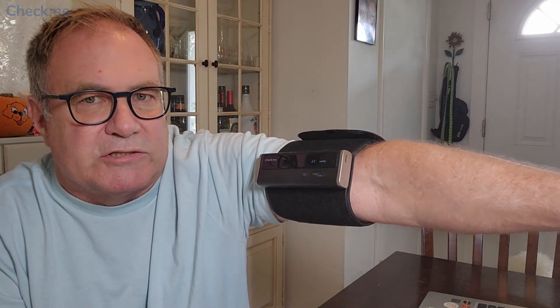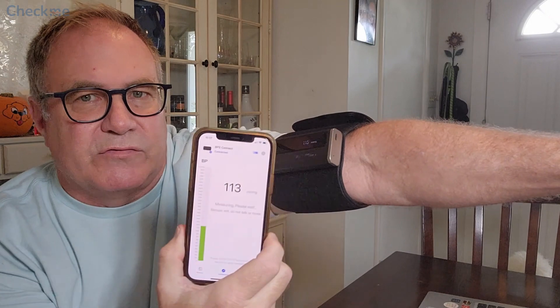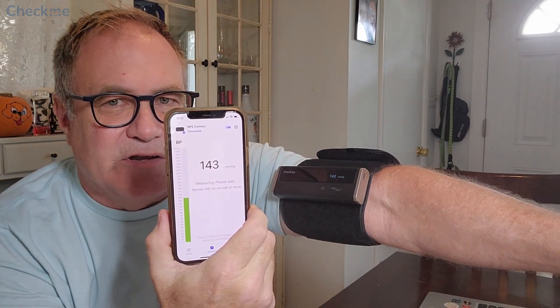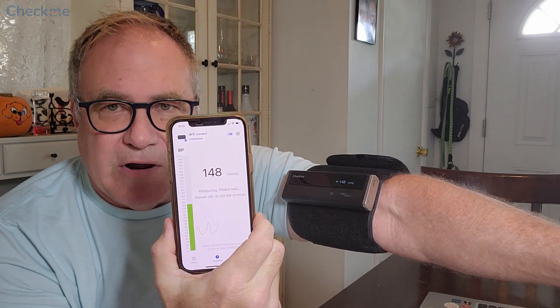I've got the armband on and it's taking my blood pressure — you can see on the monitor there. I also downloaded the app that is mirroring what's on the monitor, collecting data that you can keep historically and get a lot of charts and graphs on.